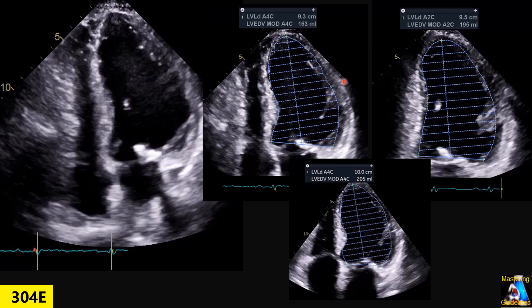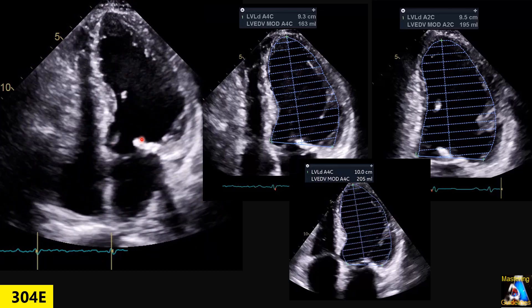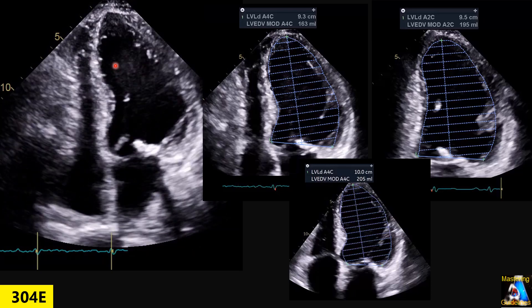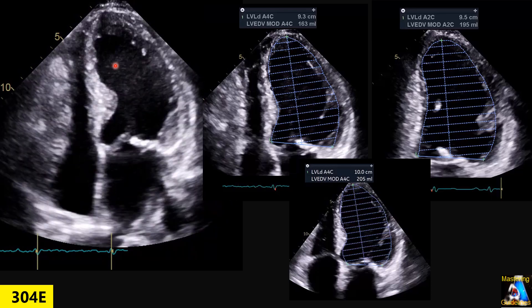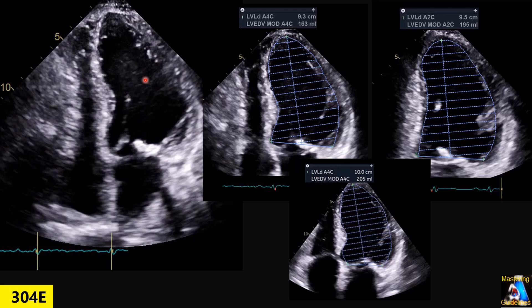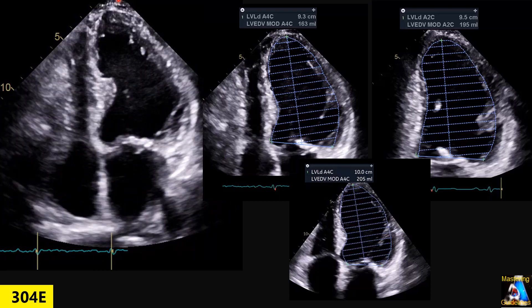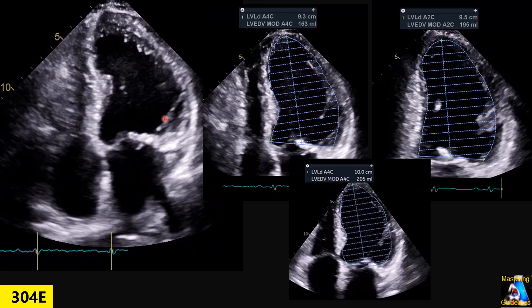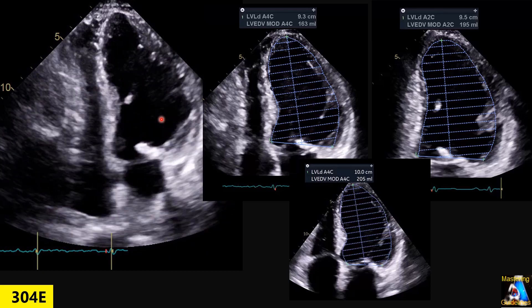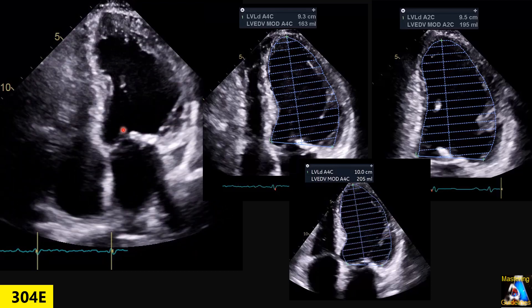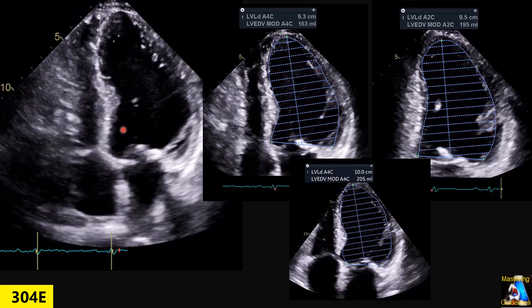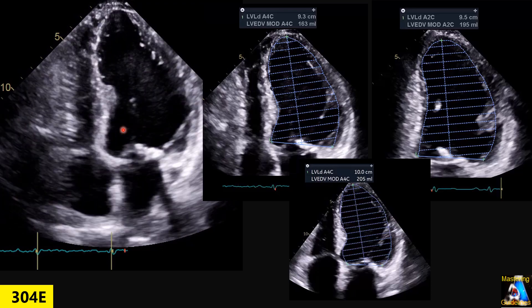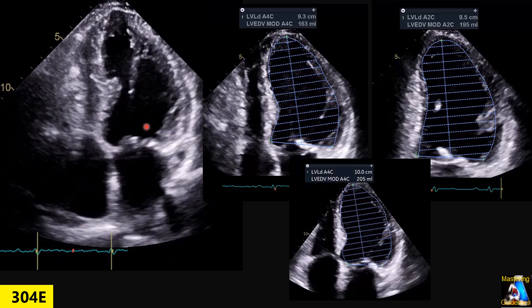When you measure, the ultrasound sector should pass through exactly the center of the left ventricle as a cone shape — whether in apical 2, 3, or 4. Even millimeter changes in where the sector passes can cause large differences in volume measurement. The general rule is: when capturing a clip for measurement, always ask the patient to hold their breath, capture at that moment with good images, and then proceed with measurement.